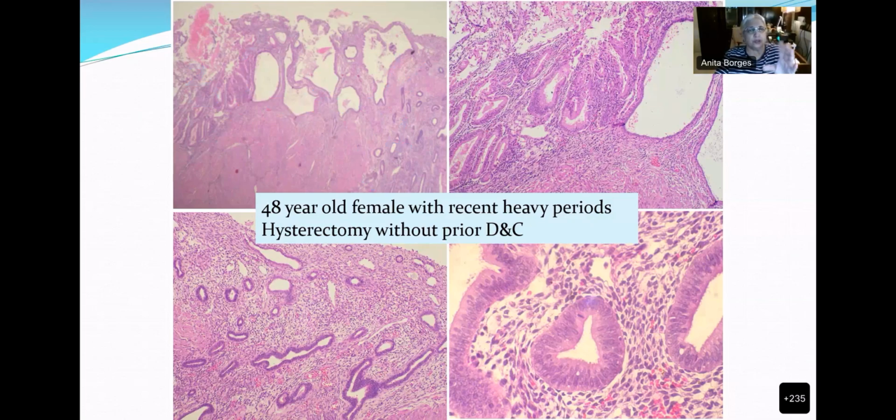So Mansi, that is a lot. You have got one zone that looks perfectly normal. Yes, that is zone number 1. Then you have zone number 2, which is showing you cysts, but apart from the cystic change, there is no cytological atypia or anything. You can see a higher power of it to the right. Then comes zone number 3, with a high power view on the right hand side top, and that has got back-to-back glands, or at least very little stroma between the cells.